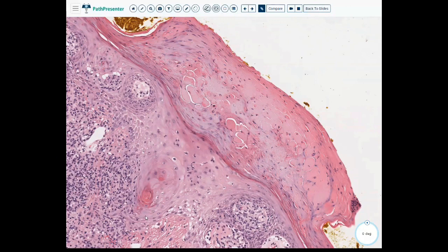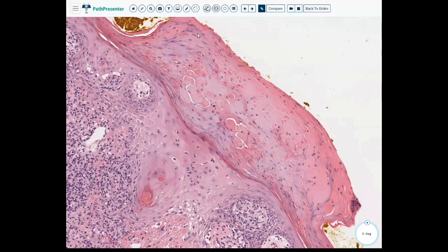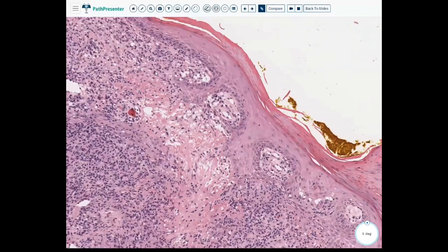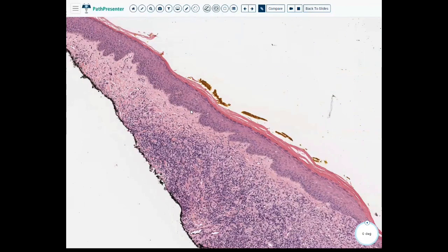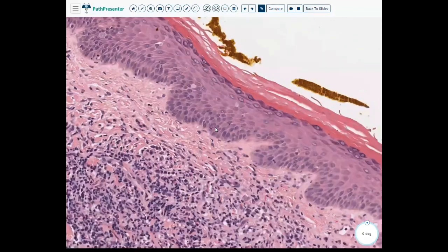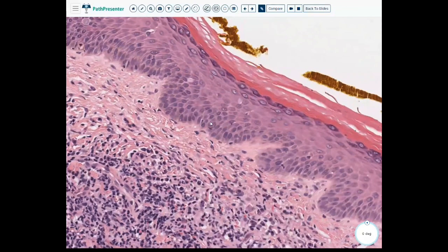The cells have central nuclei and relatively open vesicular-looking chromatin. There are some nucleoli but they're not really prominent. We have all this parakeratosis — we see the flattened nuclei. The granular layer is present but maybe somewhat diminished. Over here the basal layer is more normal, with nicely arranged keratinocytes, maturation going up, the granular layer, and then in this area we have orthokeratosis with that basket weave pattern.